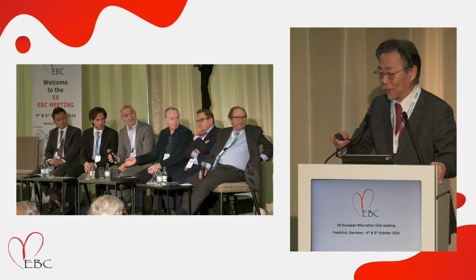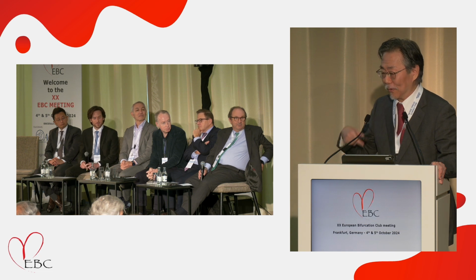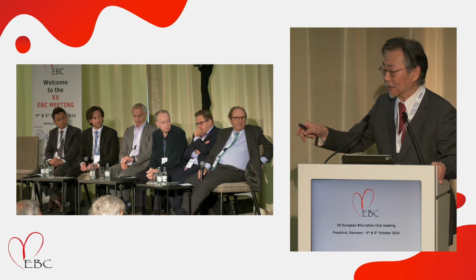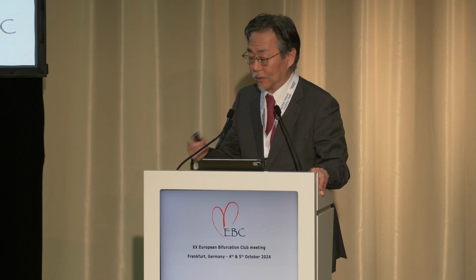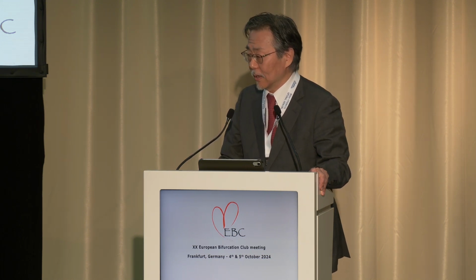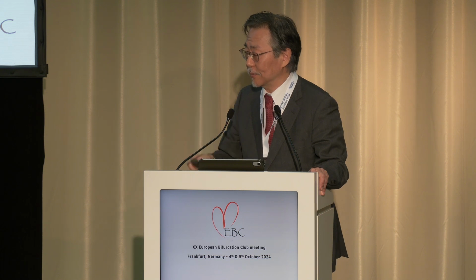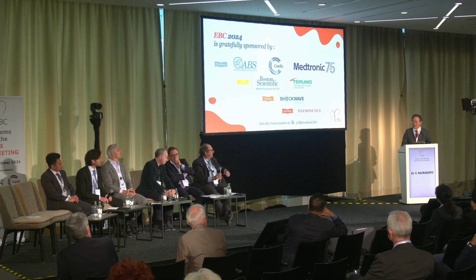This study is a historical study. So we learned that provisional stenting for the 001 region is not a good option. Debulking the plaque in the side branch and DCB is another treatment for the 001 region. Even in a small vessel, scoring of the side branch ostium and DCB is another option. So stent-less, stent-free treatment is an applicable treatment for this region.